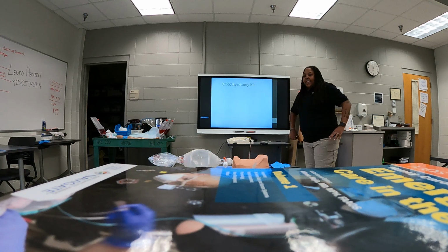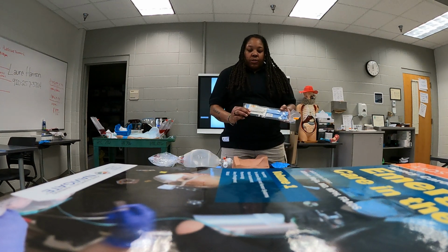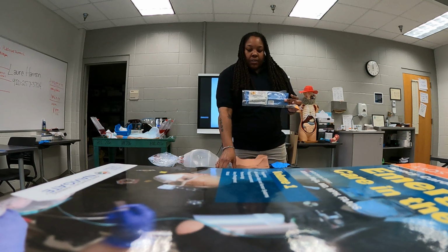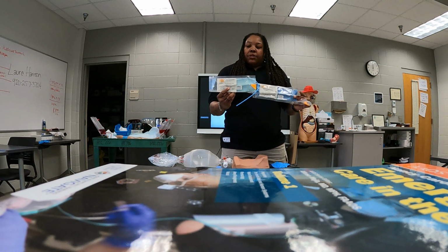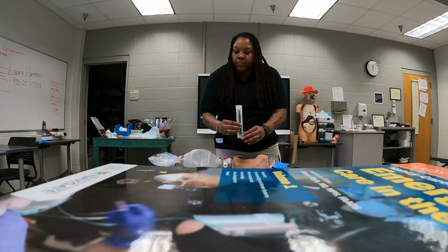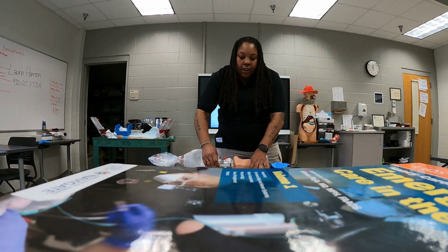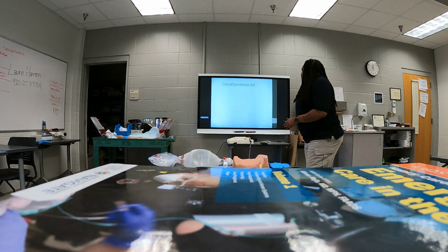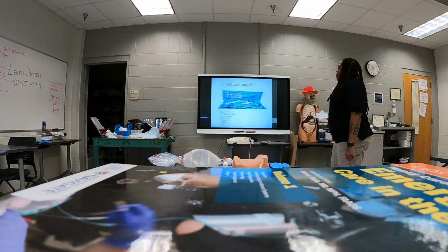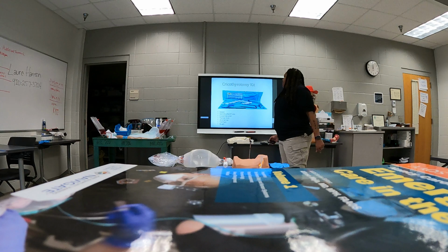The kit. So I've got this out for you all, and we'll see a little bit later on, shortly here. So you have your airway, which is a little bit shorter than your regular airway because of where you're placing that. Then you have your instruments, your bougie, and what you're going to use to apply that. You have your scalpel, and then you also have your syringe. So this is all what comes in the kit, and I've went ahead and opened that for you. So this is everything that comes in it. And like I said, we'll open that up and put our hands on the thing kind of here shortly.